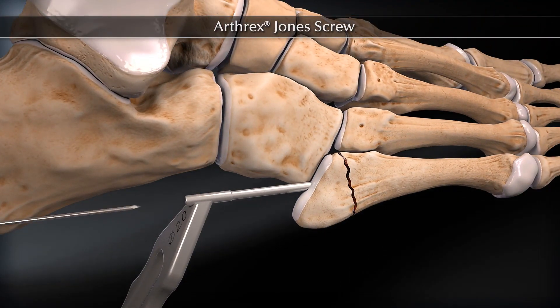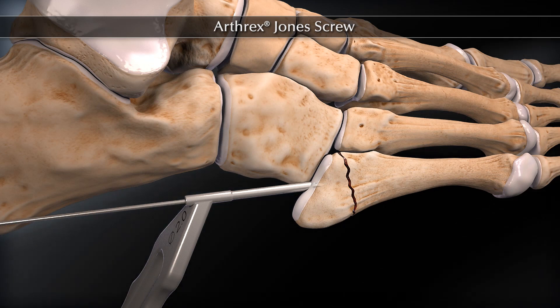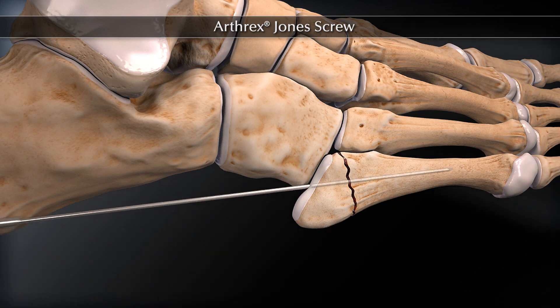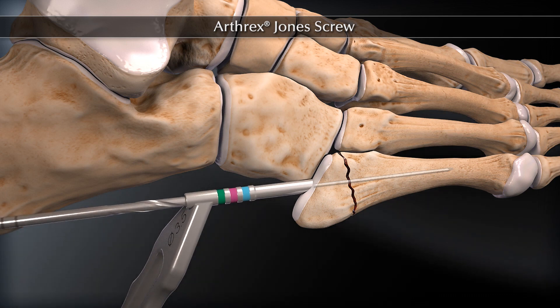Make a percutaneous incision. Insert the K-wire high and inside on the base of the fifth metatarsal. Advance the K-wire just past the fracture line or half the length of the shaft. Advance the 3.5 mm cannulated drill bit past the fracture site.